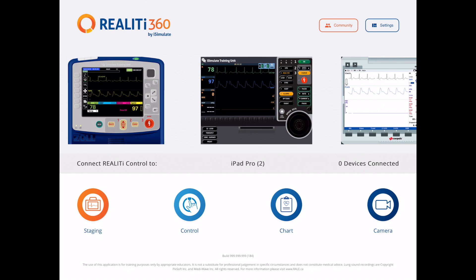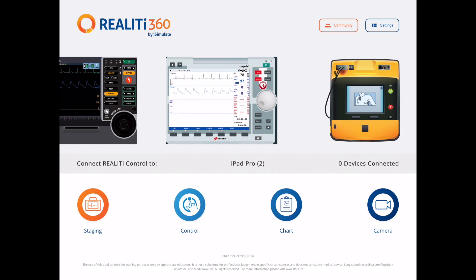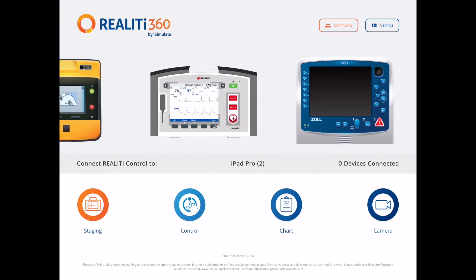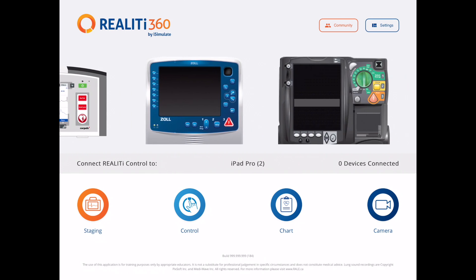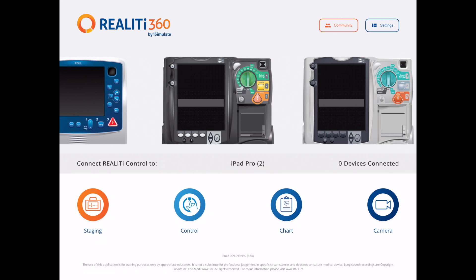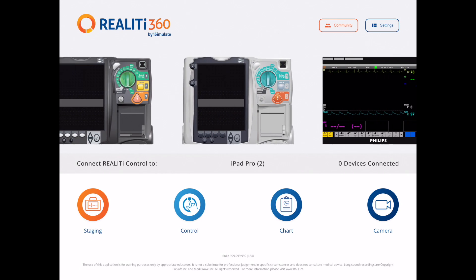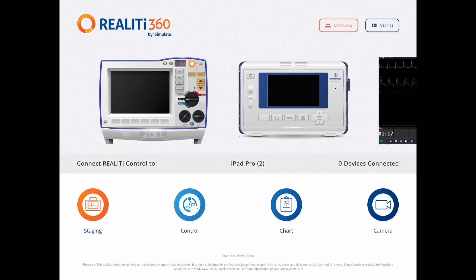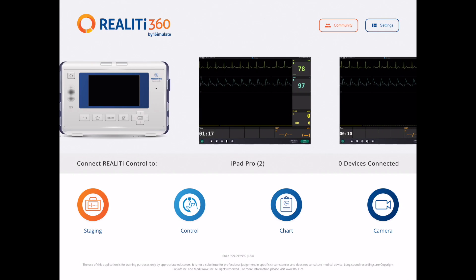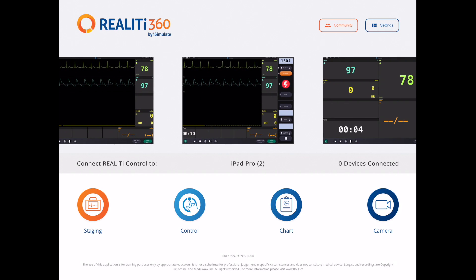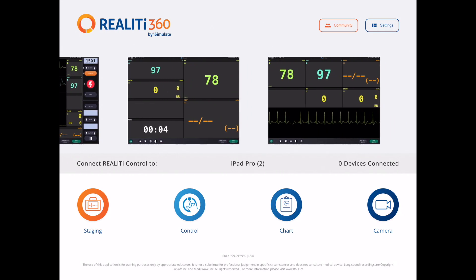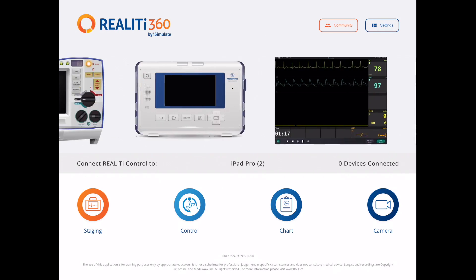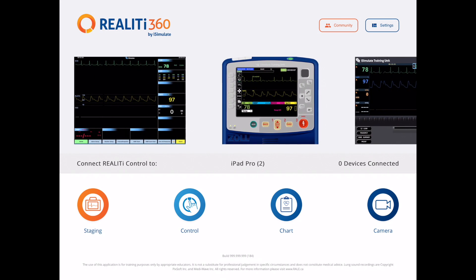You can see all of the defibrillator and monitor screens in front of you, and I'm just going to scroll across now to show all the different models that we have available. There are 14 in total, and you'll also see some generic ones towards the end there.